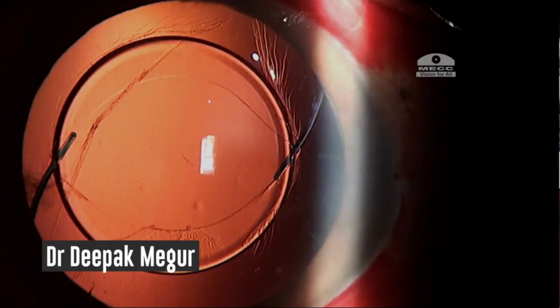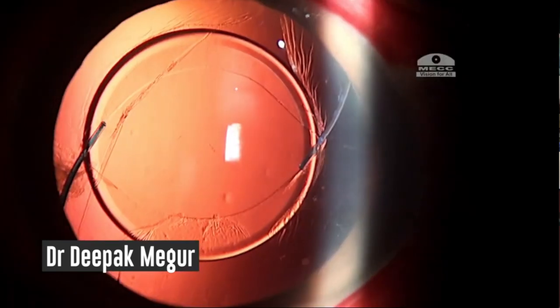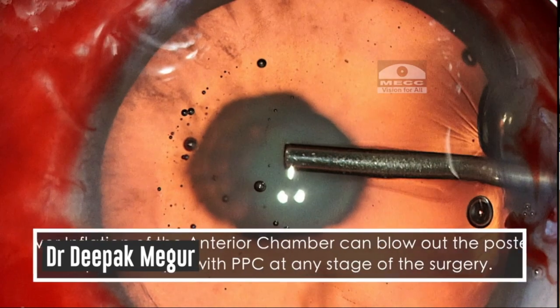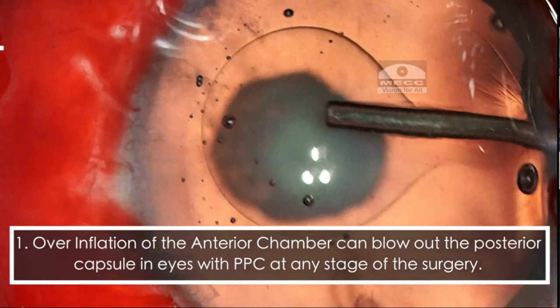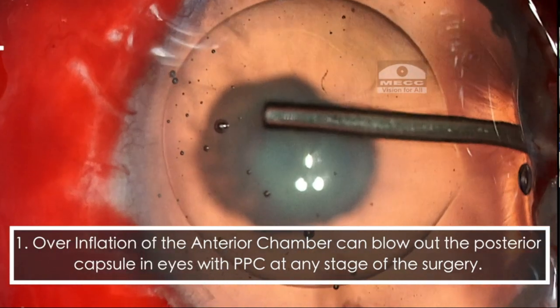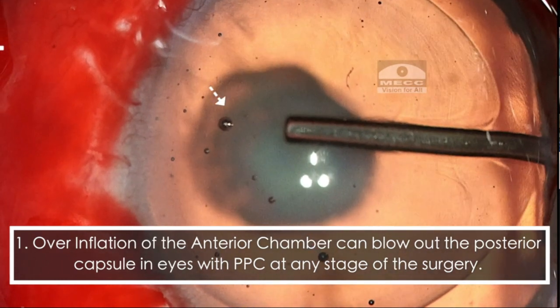I'm confirming the absence of vitreous by using triamcinolone for one last time. Diluted pilocarpine is used to constrict the pupil. And eventually the case did well. This is how the eye looks postoperatively. On dilated examination, we can clearly see that the lens is extremely well centered and is well trapped behind the rhexis margin. So what did we learn from this case?